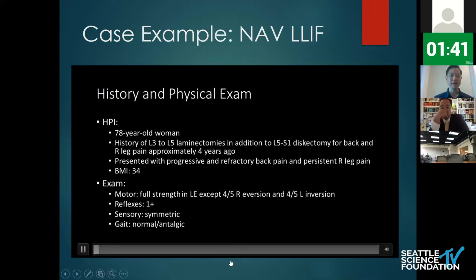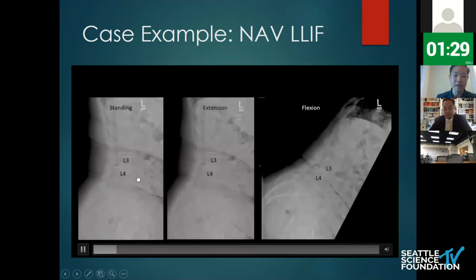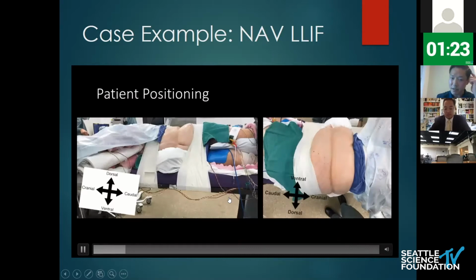This is a patient, 78 years old, with a lot of medical problems. One of our residents, Mike Strong, put this together and did a great job on it. She essentially has post-laminectomy instability and stenosis, with an L3-4 distribution radiculopathy. You can see the spondylolisthesis that develops after the laminectomy. So at 3-4, that's our target area.